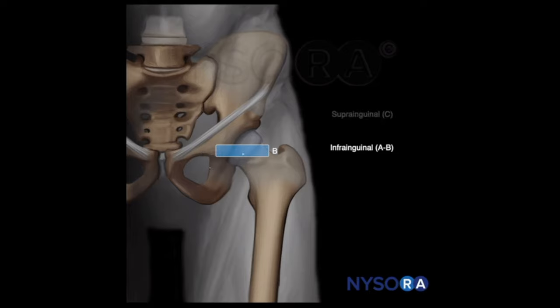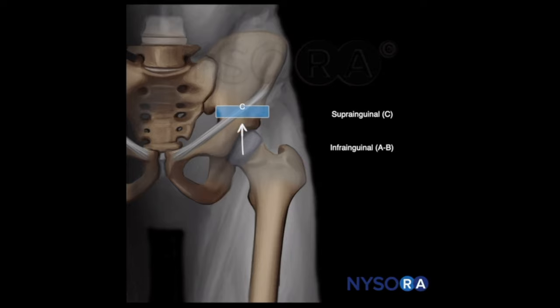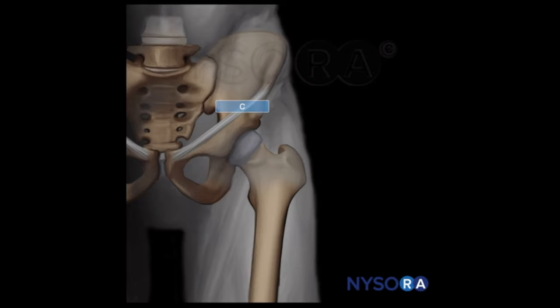For the suprainguinal fascia iliaca block, the transducer is moved proximally and should be over the anterior inferior iliac spine. At that point, the fascia iliaca is identified and local anesthetic is injected underneath the fascia iliaca to reach the lumbar plexus.